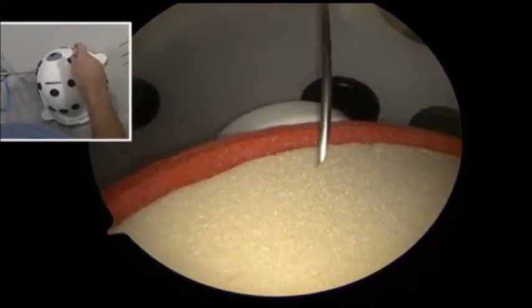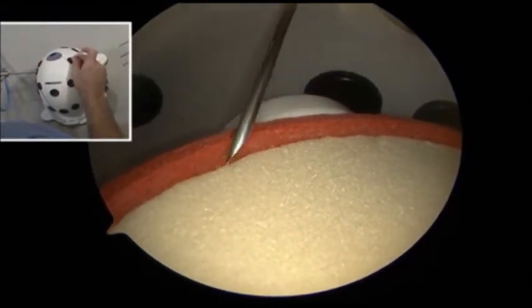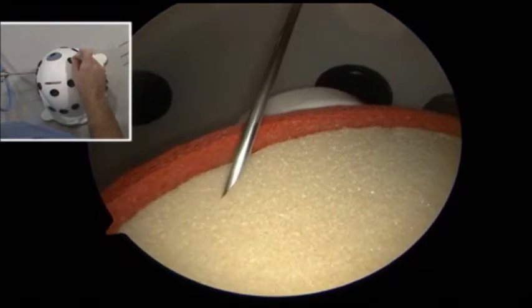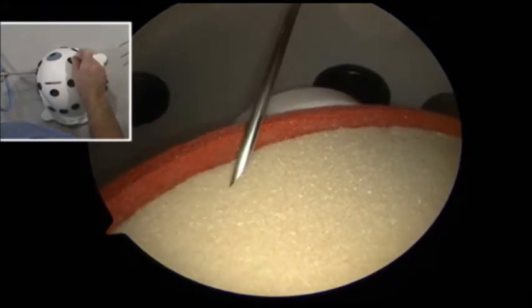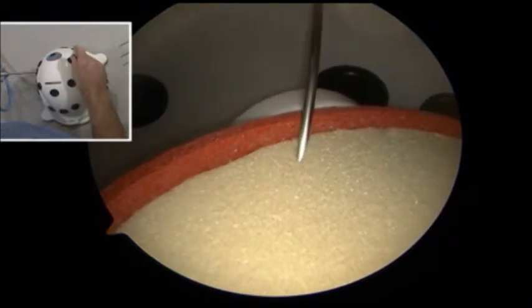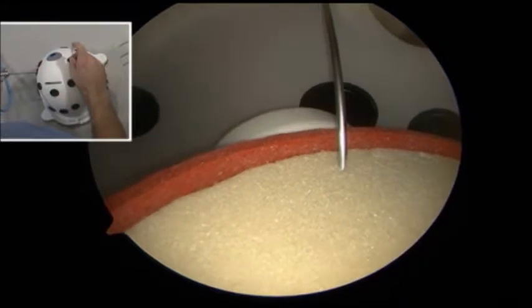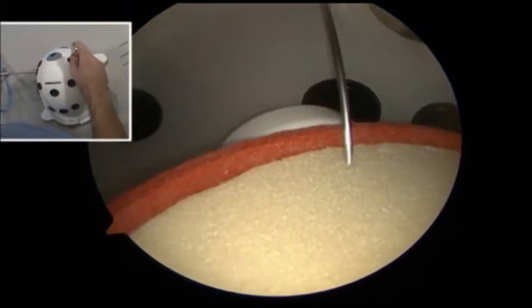This is our simulated glenoid. We want to have our anchors onto the face of the glenoid. Typically we'll start at the inferior most position, and we're going to try for a 3 anchor repair here. So we would put one anchor here, and another anchor here, and another anchor up here, and all seem like they would be able to come through that low portal.